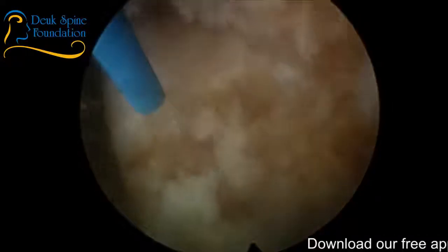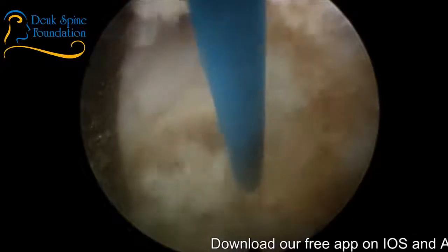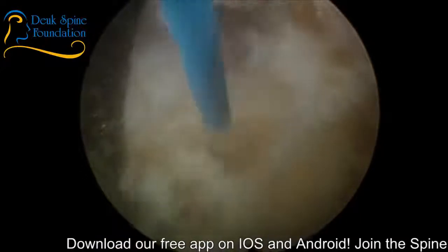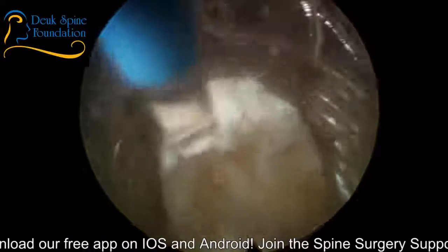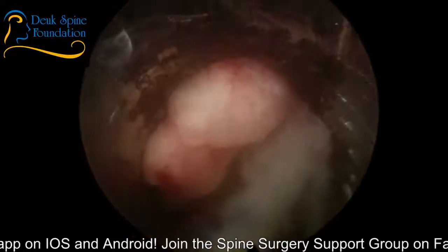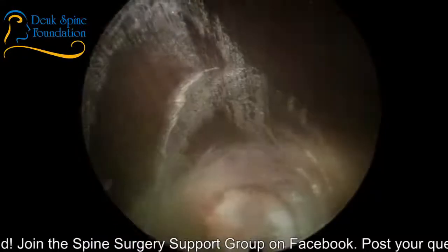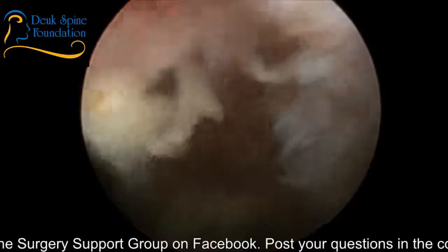I'm in a part of the spine called the lateral recess. That's the most common place you get stenosis or narrowing that pinches the nerves. So I've taken out the herniation in the lateral recess. Let's see what we've got. There should be a nerve root up here inside that fat. That's pretty much it though. We've done everything we can do. That's epidural fat. So laser out, laser off.